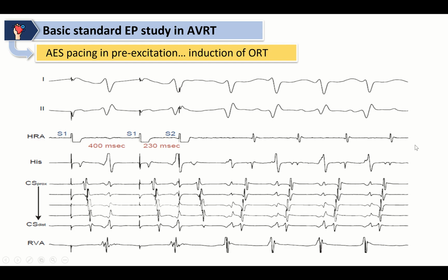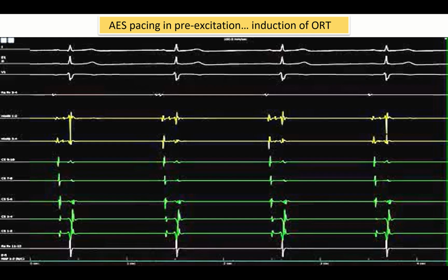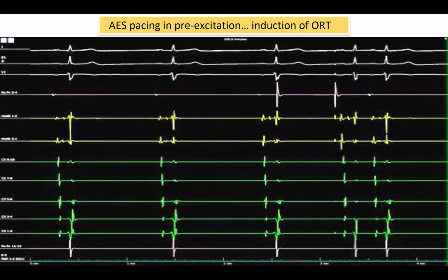It is confirmed to have orthodromic tachycardia using a left lateral accessory pathway.